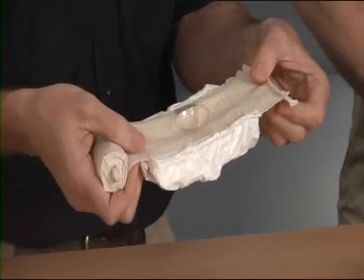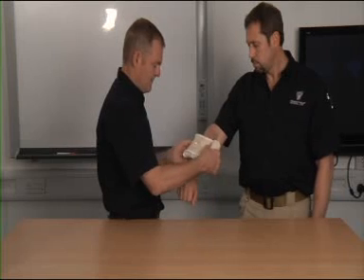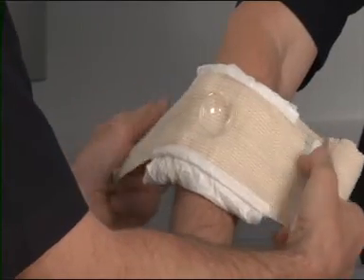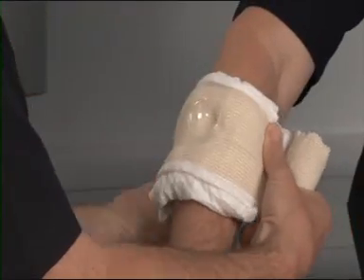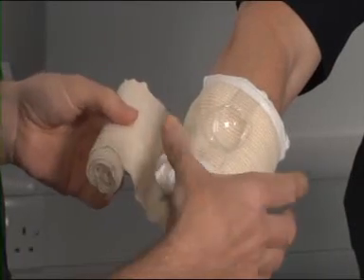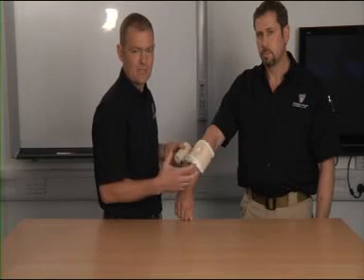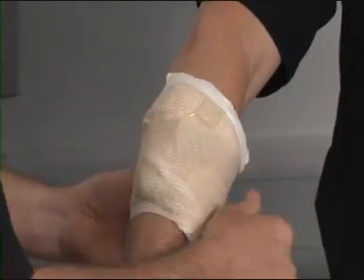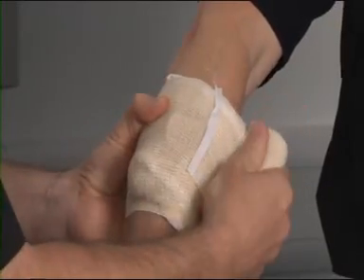First of all, you can see there's a plastic cup on the upper surface of the bandage. We apply the bandage over the wound with the cup aimed centrally over the wound itself, and with the hook and loop material on the end of the bandage, the first wrap around is enough to secure it roughly in place, so that we can then think about application of pressure and not worry about having to hold the bandage in place.